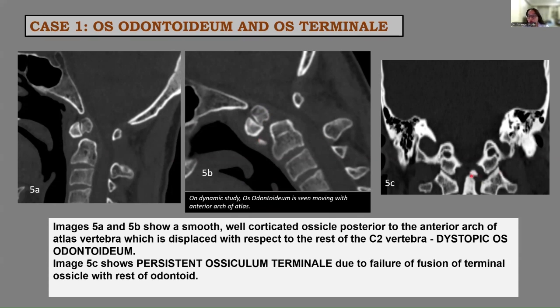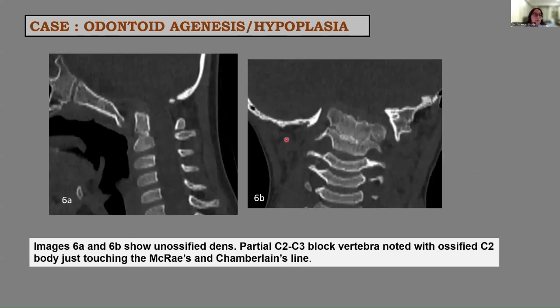Image 5C shows a tiny ossicle just at the tip of the odontoid process, suggestive of persistent ossiculum terminale due to failure of fusion of the terminal ossicle with the rest of the odontoid. Coming to odontoid agenesis, images 6A and 6B show an un-ossified dens with partial C2-C3 block vertebra, and the ossified C2 body just touching McRae's and Chamberlain's lines, suggestive of odontoid agenesis with basilar invagination.